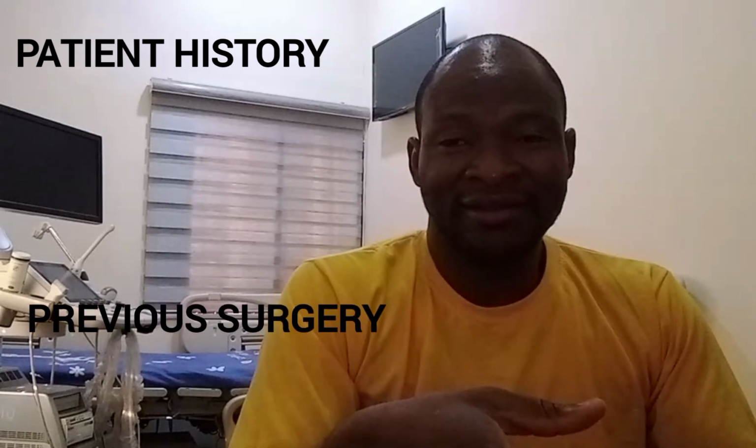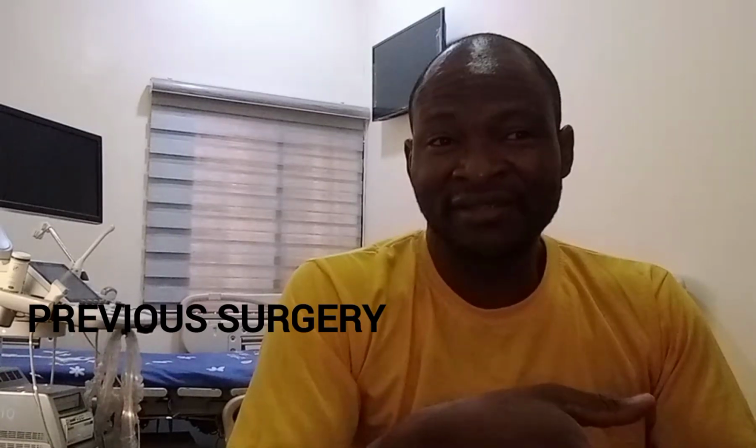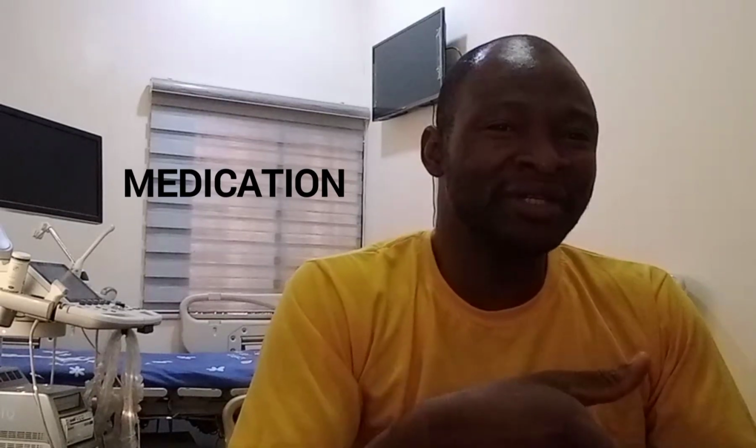So you want to ask your patient if there is any complaint, if there is anything they feel or observe in their body. Also history of previous surgery, where such is the case. You also want to know about medications, whether the patient is on medication or has been on medication, and also whether they are on IUCD.